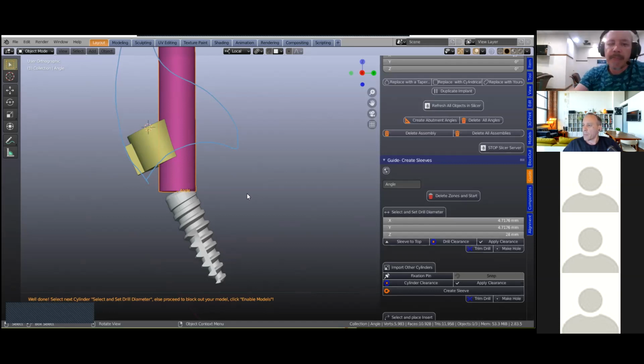Do you include also tie bases? Yes, Wolfgang, we've got tie bases as well. We've got everything under the sun from Medentica. So abutments, angled abutments, tie bases, multi-unit, angled kinds of things. So for crown and bridge work, that's ideal.